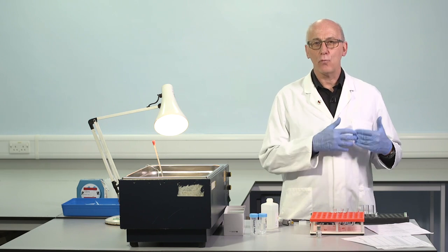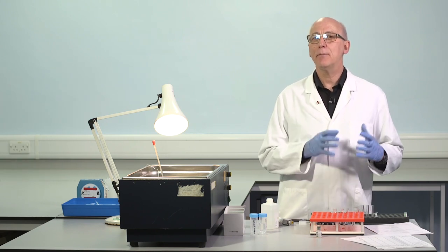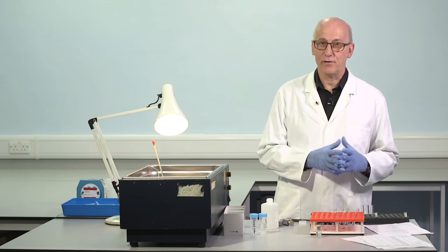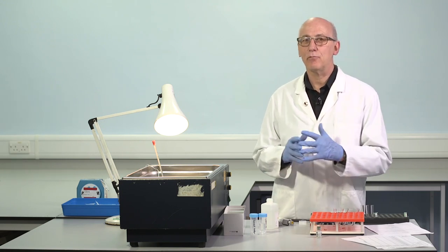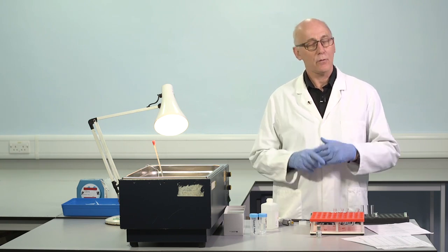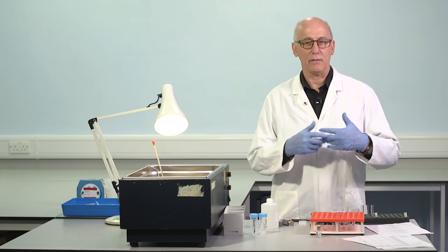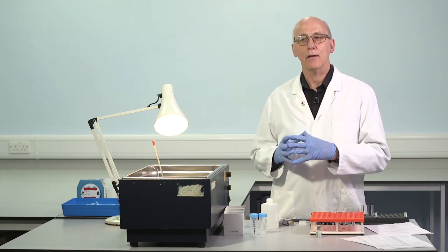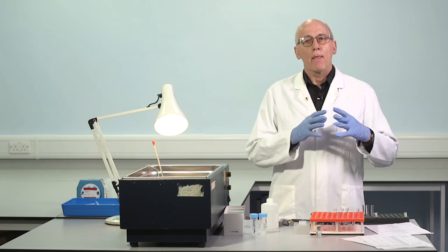We're trying to create in one of those pre-dilutions an inhibitor concentration somewhere close to 1 Bethesda unit per mil, so that the residual factor VIII will be somewhere close to 50%. You'll see when we make the plot how we fully quantitate the assay. And again, it's described in some detail in the WFH lab manual.